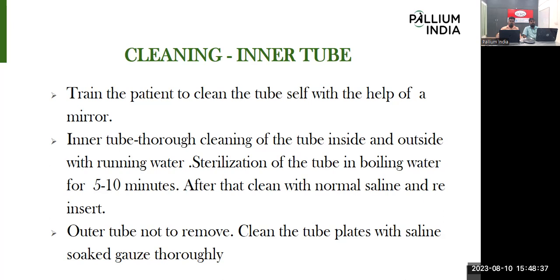After the cleaning procedure, they need to ensure the inner tube is completely dry, without even a droplet of water. After complete drying only, they can reinsert or reuse the inner tube in the outer tube. The outer tube is not to be removed by the patient; only the inner tube they can remove and clean. Then they can clean the outer part, the face area of the outer tube only, thoroughly using saline-soaked gauze.